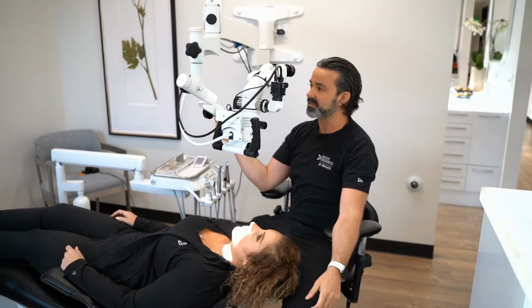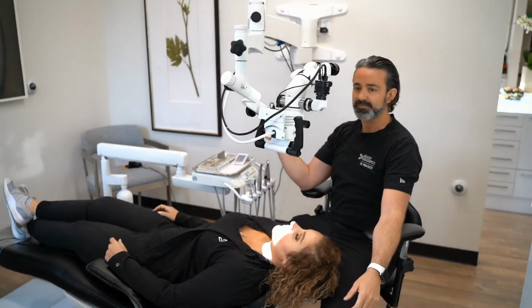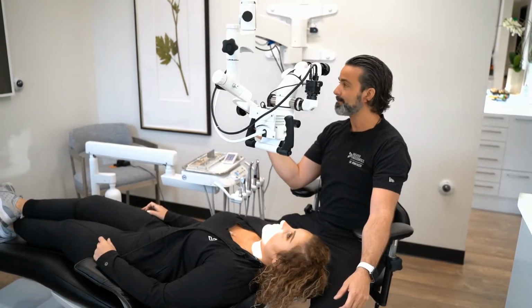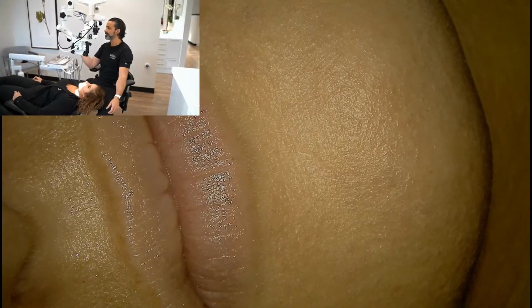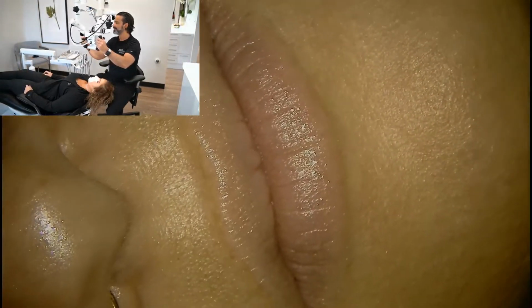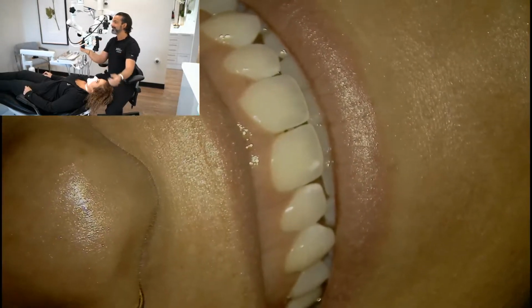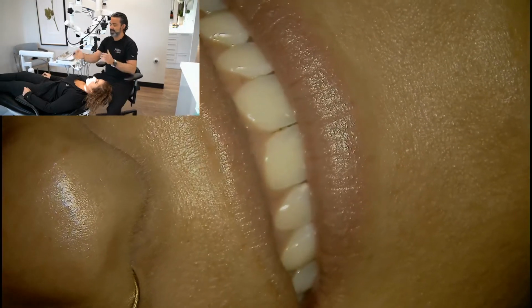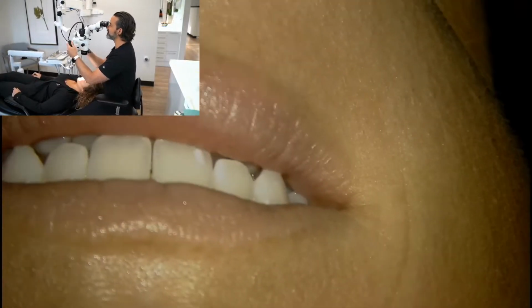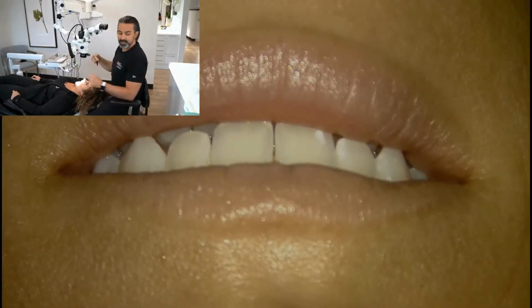If you want to see, I've got her up on the screen. Do you want to do the intraoral view? Maybe on the laptop, hit the second one, intraoral, picture in picture. There you go. So you can see that the smile's off, and sometimes people like that perspective. But what I've learned is if I come over the head like this and kind of put the smile like this, and then now open, and then hand me a mirror.